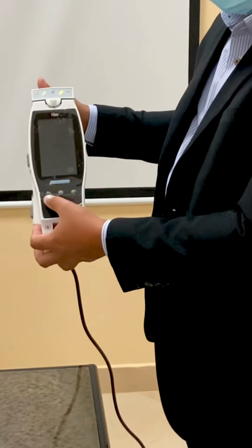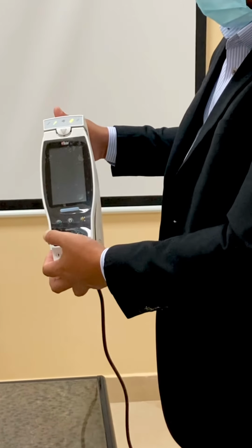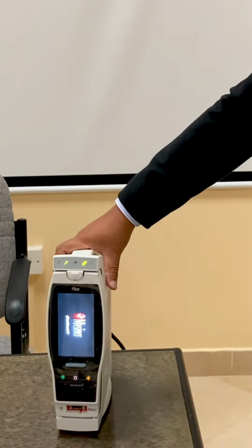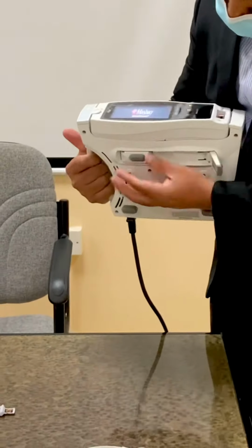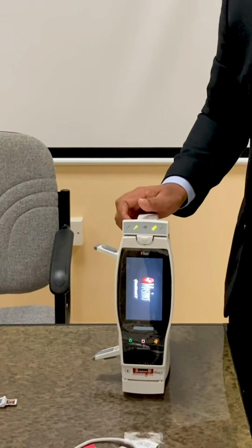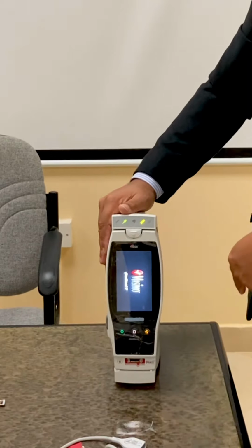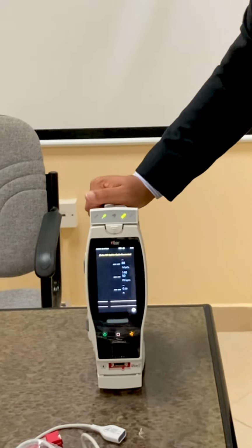How to switch on the device? Switch on the device here. Press the power button. Press and release, and it will be ready. We'll wait for a second, and then the system will boot, and then you can either place the module like this, or you can place it here, and then place it like this. The preferable method is like this, so that you can save more space when you don't have space. The system will automatically align the screen according to your view, or according to the position of the docking station. You can see it now.